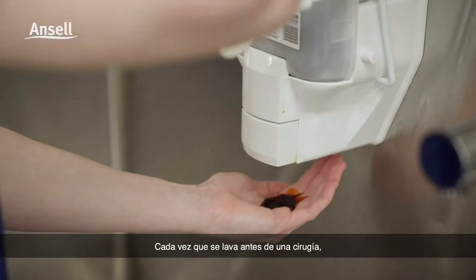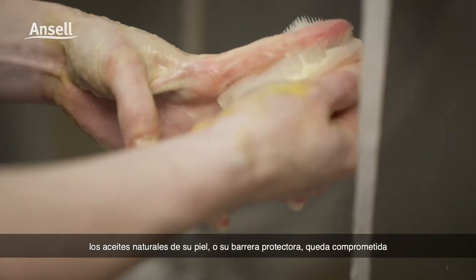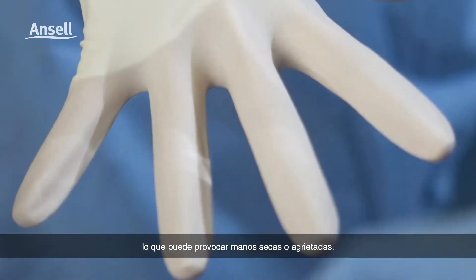Every time you scrub before surgery, your skin's natural oils or protective barrier is compromised and may result in dry or chapped hands.